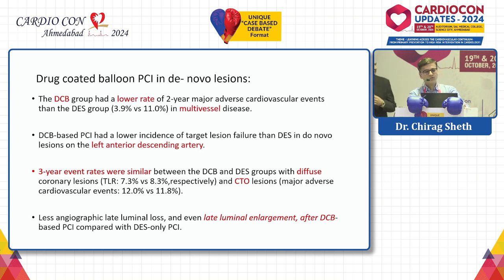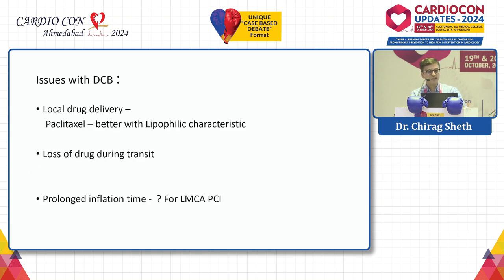Moreover, they have also shown that angiographic late lumen loss is much less with the drug-coated balloon, when paclitaxel has been used, compared to drug-eluting stent-only PCI. All these have been relatively small studies. We don't have large randomized controlled trial data to really bank our decision upon. Issues with the drug-coated balloon are which drug, sirolimus versus paclitaxel.